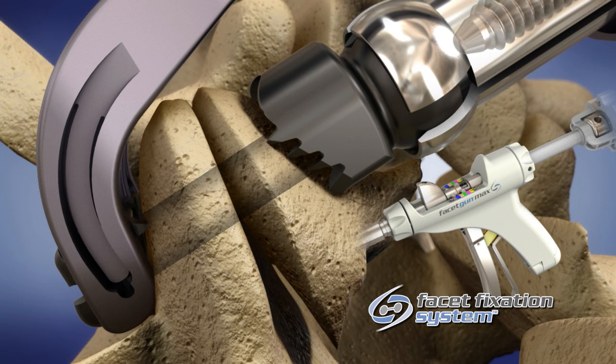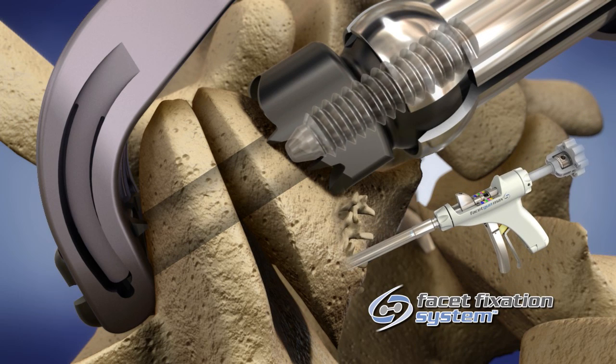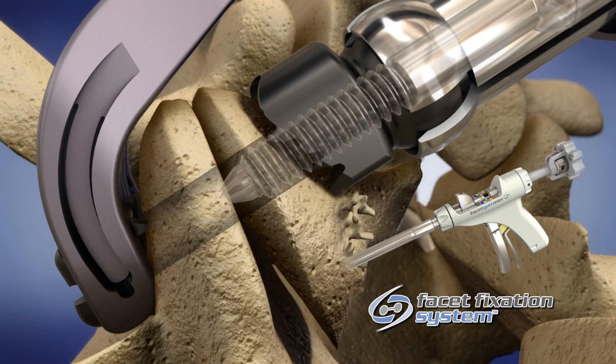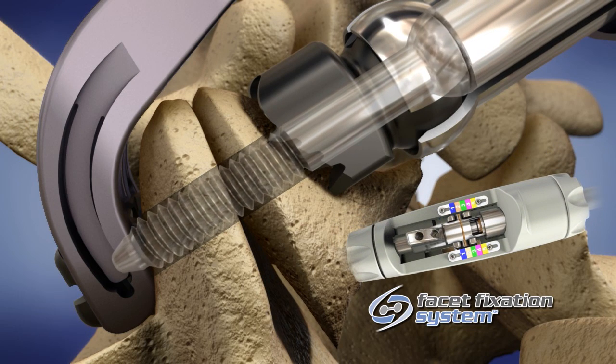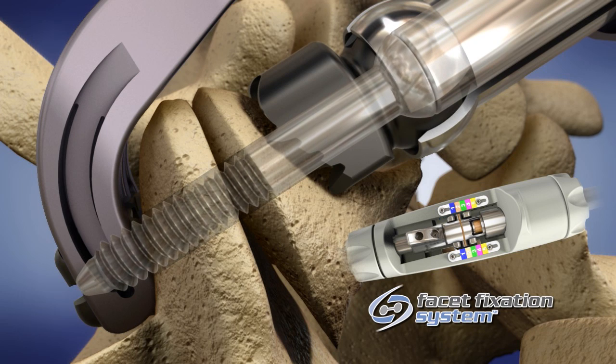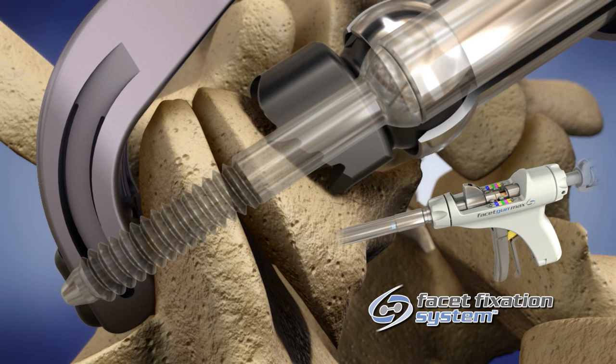The screw is advanced by turning the driver clockwise until the hard stop is reached. Progress can be viewed through the window at the top of the gun behind the roll controller. When the yellow stripe from the driver is visible in the window, the driver is nearing the hard stop. Continue to advance until the facet screw has fully driven through the locking washer and you are unable to drive any further.